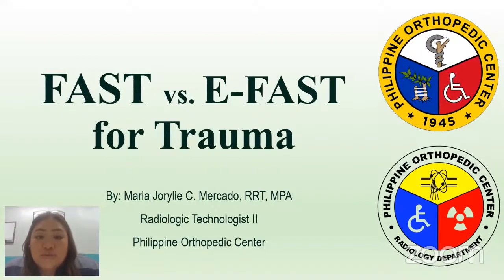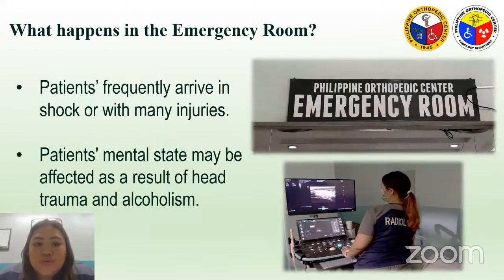So my presentation for tonight is all about FAST versus E-FAST for trauma. So first of all, what happens in the emergency room? I would like to start by having an overview of what happens in the ER.